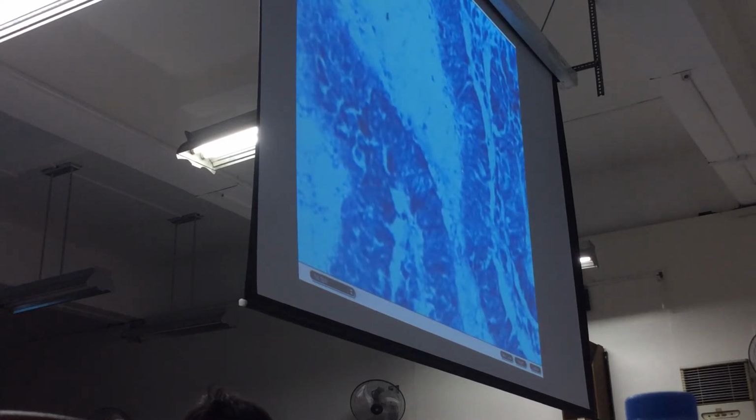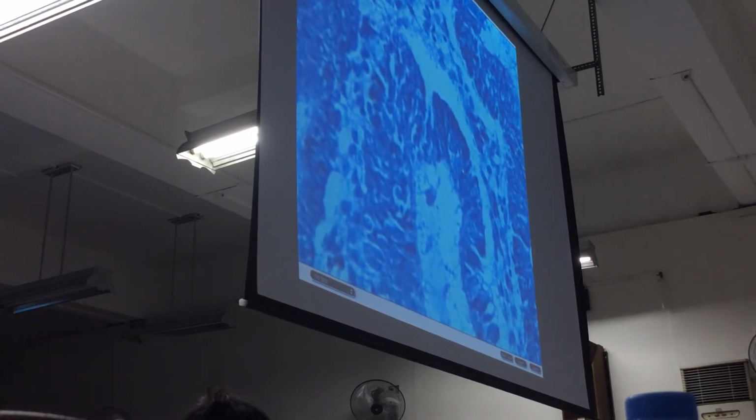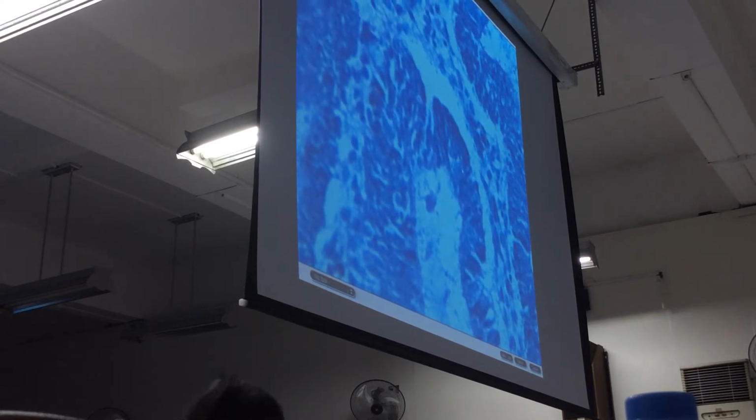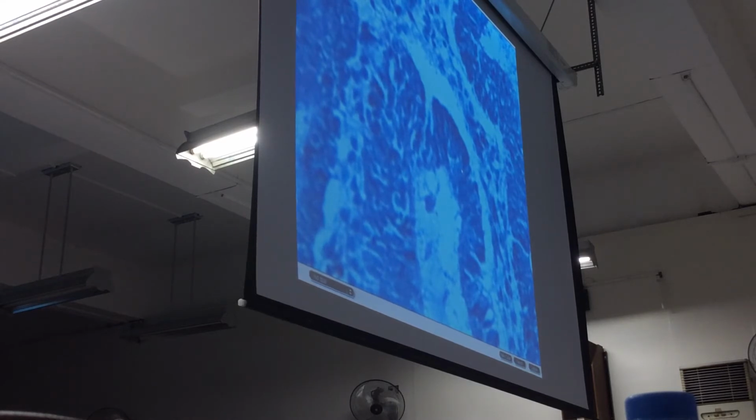That's complex hyperplasia with atypia. Same slide, but the ones without the rounding of the nucleus, hyperchromasia, and etc. That's complex hyperplasia because of the architecture na dikit-dikit yung glands mo, without atypia.